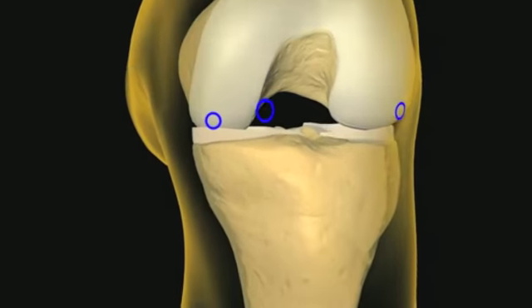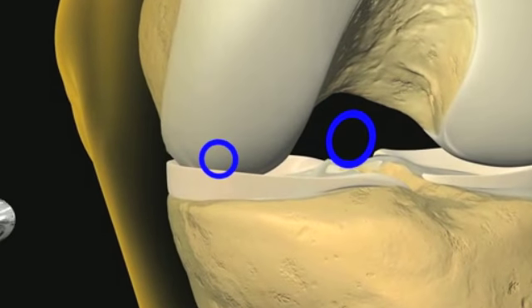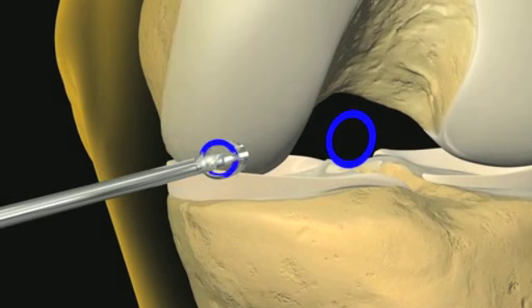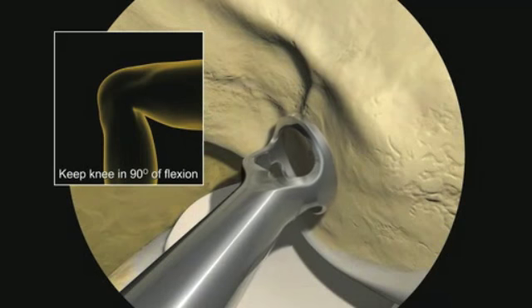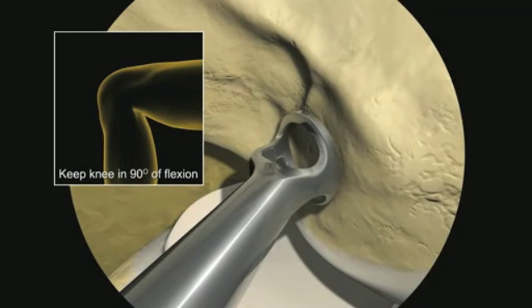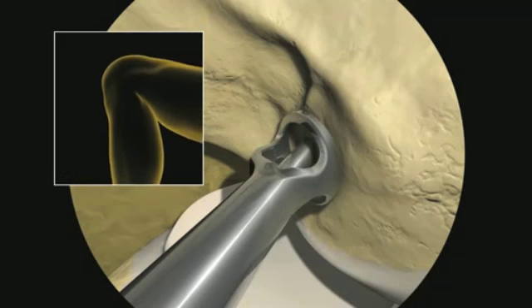With the ACL footprint identified and the center marked, insert the bullseye femoral footprint guide into the accessory anteromedial portal with the knee flexed at 90 degrees. Place the guide at the center of the ACL footprint. Once the correct position is achieved, advance the guide pin into the femur a few millimeters to notch the bone. Back the guide pin out to check that the guide pin correlates to the mark you made earlier in the center of the footprint. Using the guide to position the guide pin, hyperflex and elevate the knee.